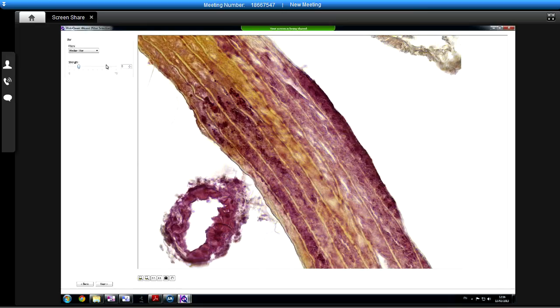What about when we look at things like this? Are we interested in this red as well? Where's our threshold, do you think? Yeah, I wouldn't really want to count this. This is the lamina. So how do you do it manually at the moment? We've not quantified. Okay, so let's have a look at that.